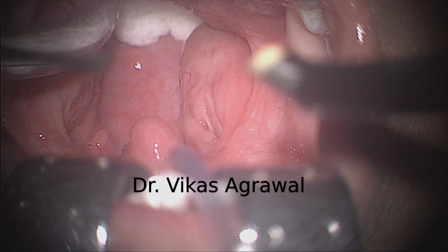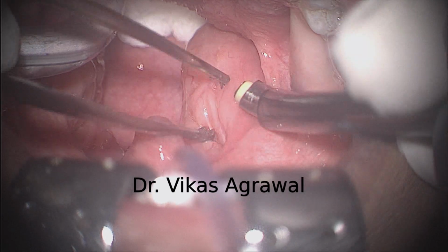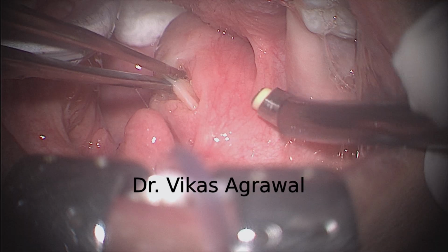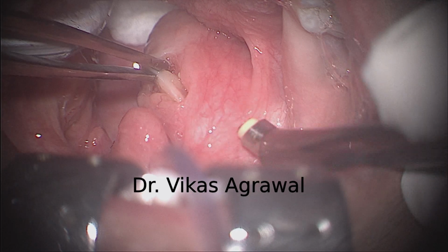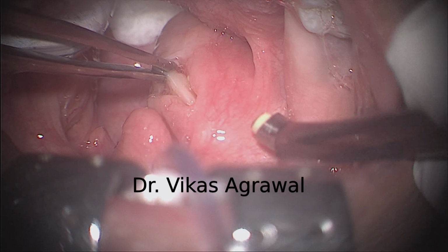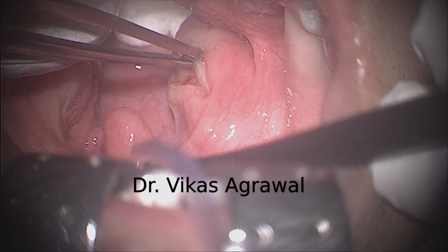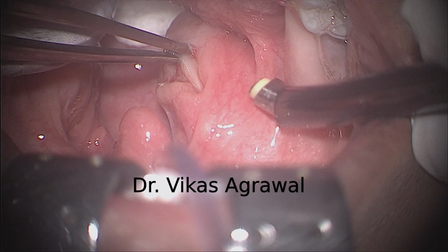So here you are watching coblation tonsillectomy in a 9-year-old child with history of obstructive symptoms. We are also going to do adenoidectomy and septoplasty, turbinoplasty at the same time. Now you can see how large the tonsil is. It's inside, it's right here. I'm starting with, you can see the palate is suspended by the rubber catheter.